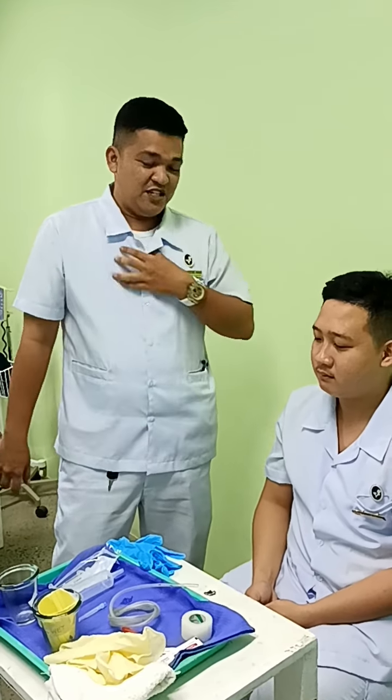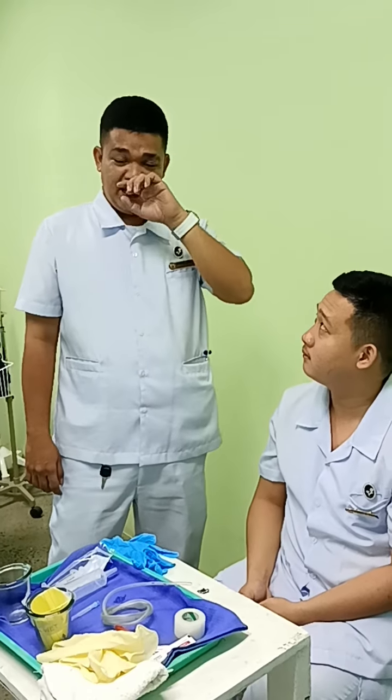So hello everybody. We're up again for another third demonstration for today, which is nasogastric intubation. First, we have to assess the patient for enteral administration.